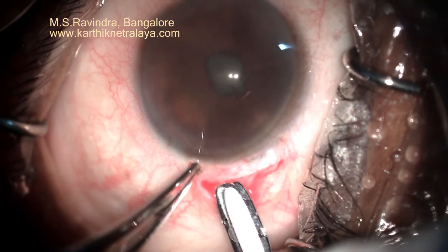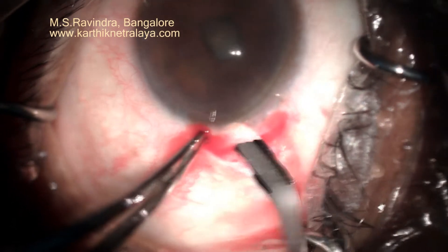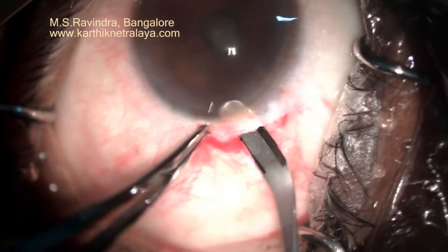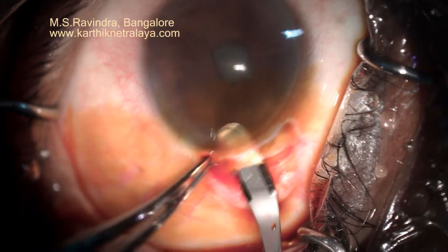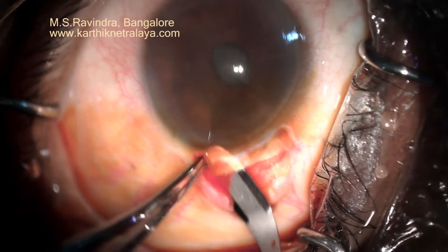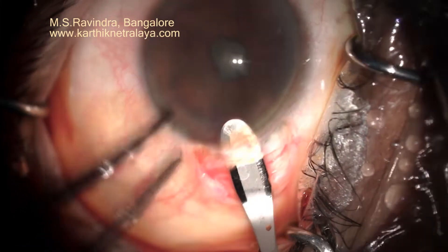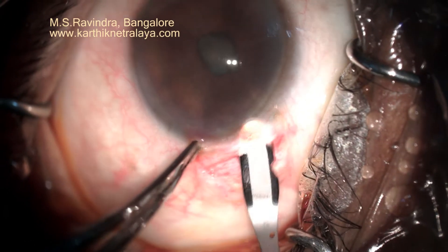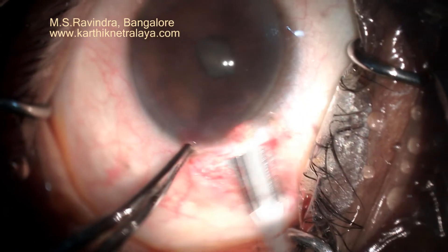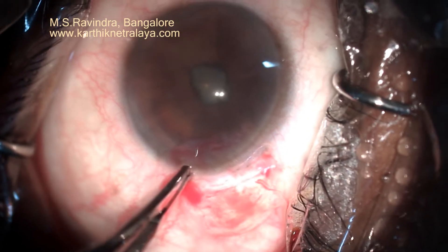A 6 mm sclerocorneal tunnel is made in the upper temporal quadrant of the left eye. I had operated the right eye a few days ago and the patient is extremely happy, just to comfort the other eye. The tunnel is made at mid-level; the measurements are about 2.5 mm in the radial direction and about 6 mm in the circumferential direction.